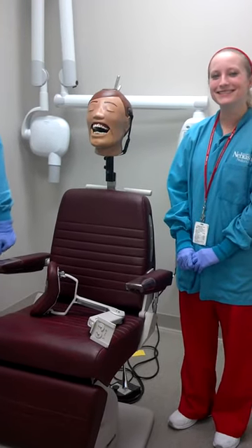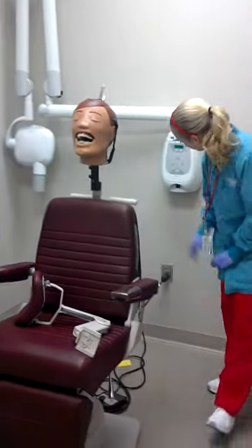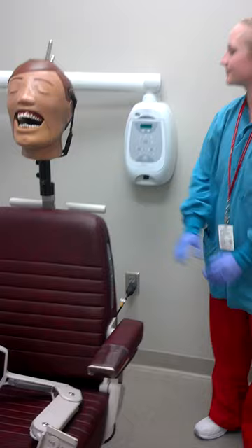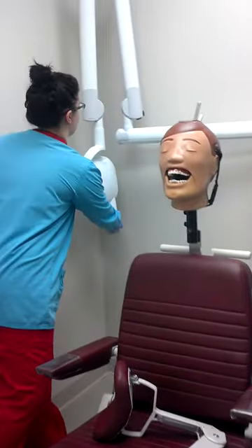Hello! We will be showing you how to take a maxillary lateral occlusal radiograph today. Make sure the unit is on by switching the power switch to on, and make sure you have the setting on the anterior setting.